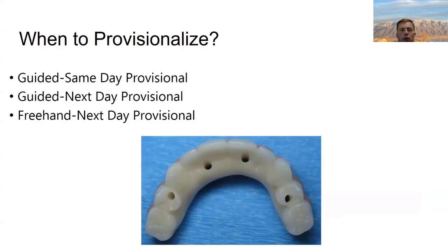So one of the huge variables is, when are you going to provisionalize the case? Are you going to do same day or next day provisional? Now, if you want to convert dentures, more power to you. That's the same day. It's very time consuming. I can do it, but I don't like to. So I feel like with digital workflows, the only straightforward same day one is guided.